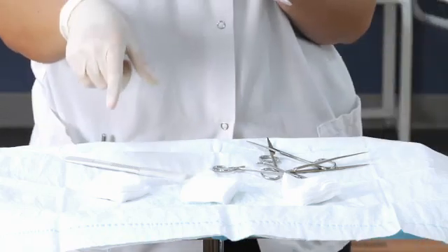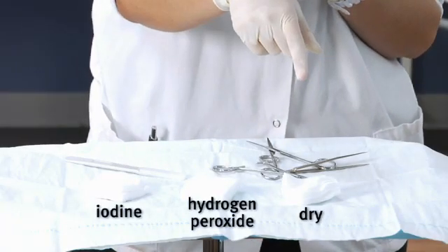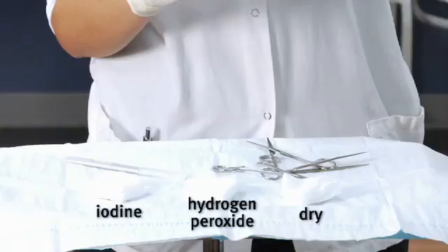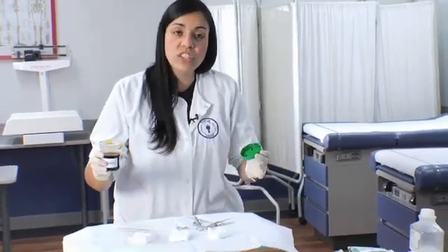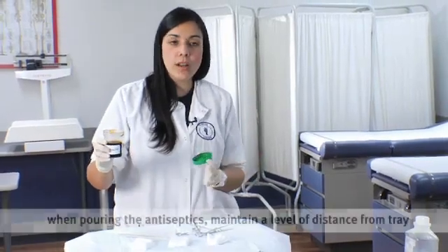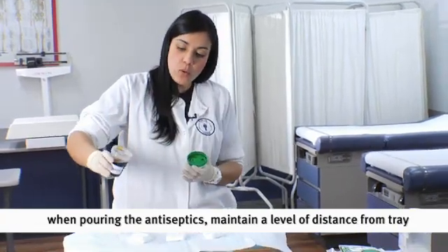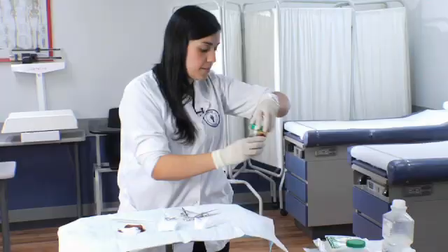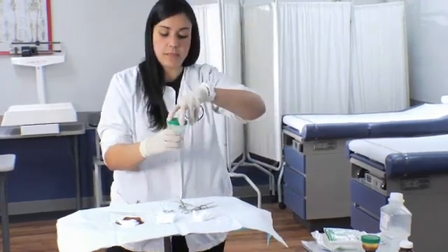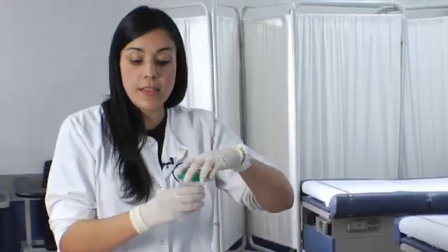Let's go ahead and start with the iodine. You'll notice I have three separate stacks of gauze left on the sterile field. You want one for the iodine, one for the peroxide, and one left dry just in case. When you pour this on for the physician, what you mainly want to focus on is that you're not reaching over or touching the field because then you can contaminate it. Maintain a level of distance — I personally like to be at least at shoulder level — pouring the contents directly onto the gauze. There goes the iodine, then hydrogen peroxide, and the last one left dry.